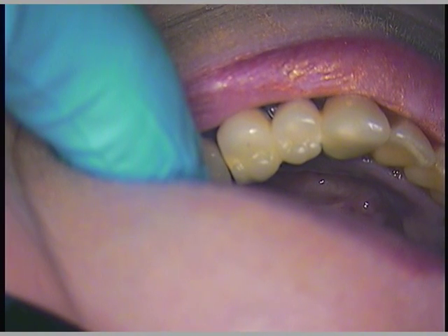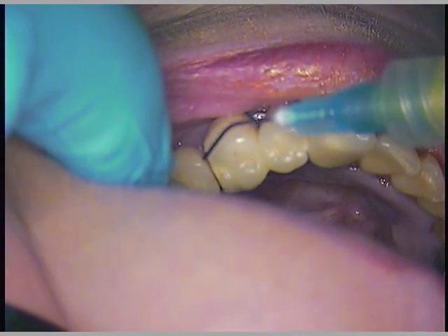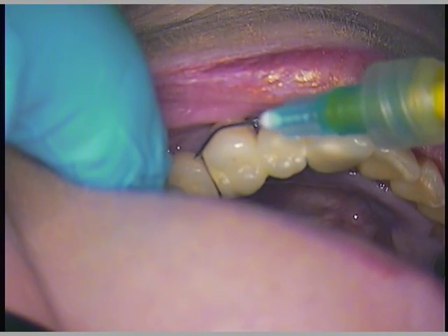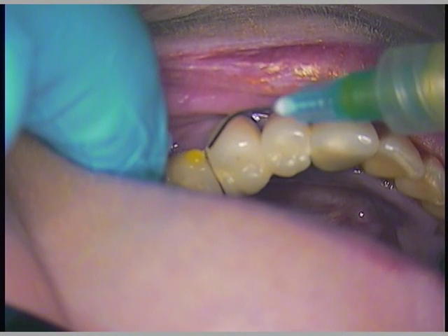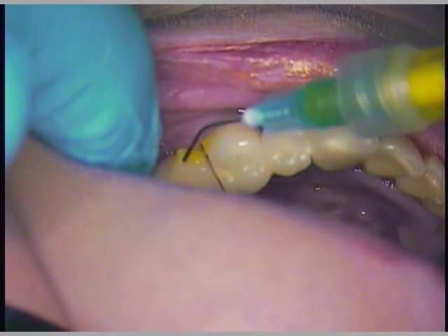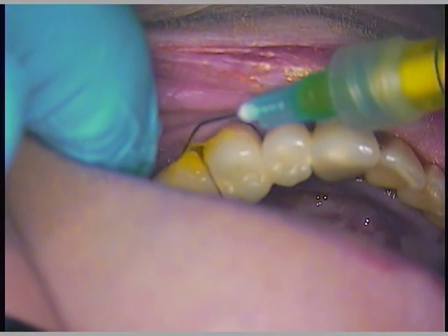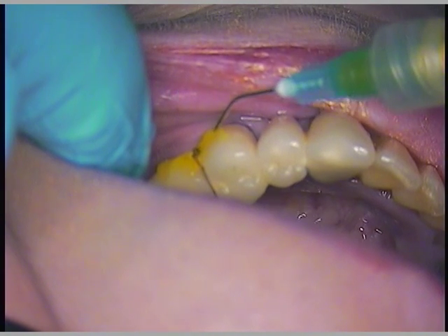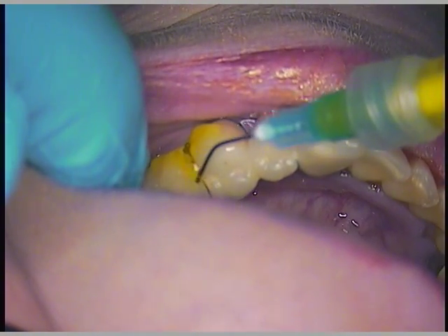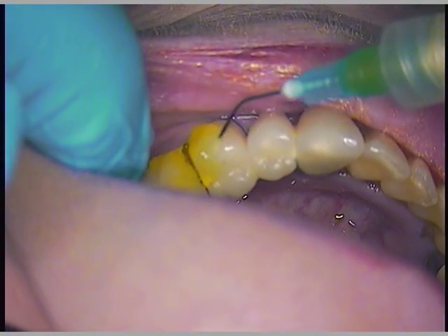First things first, we're going to go ahead and add our ceramic etch, and we'll do this from the buccal aspect. I'll need a small brush. It's easy to remove, so we'll just do everything from the facial, and a little bit occlusally — kind of like this one-fourth area.